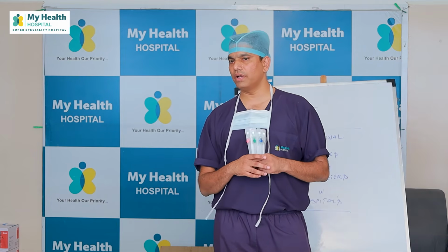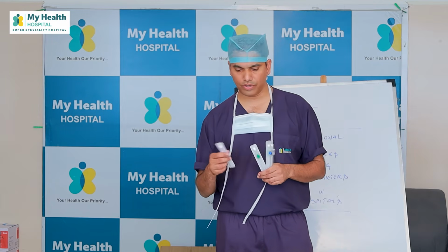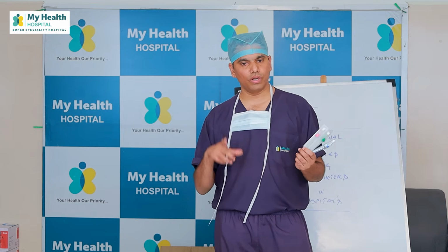What do we connect into? IV set. So when you connect into IV set, the flow rate, if somebody is asking, I need 150 ml per hour. 150 ml per hour can be done with which one? So it can't be done with 22, because the caliber is slow. However much we push, the maximum we can get is around 75 to 100 ml if the caliber is good. But with an 18, we can go to bolus. We can give 150 ml. That is delivered comfortably. That is the main reason.